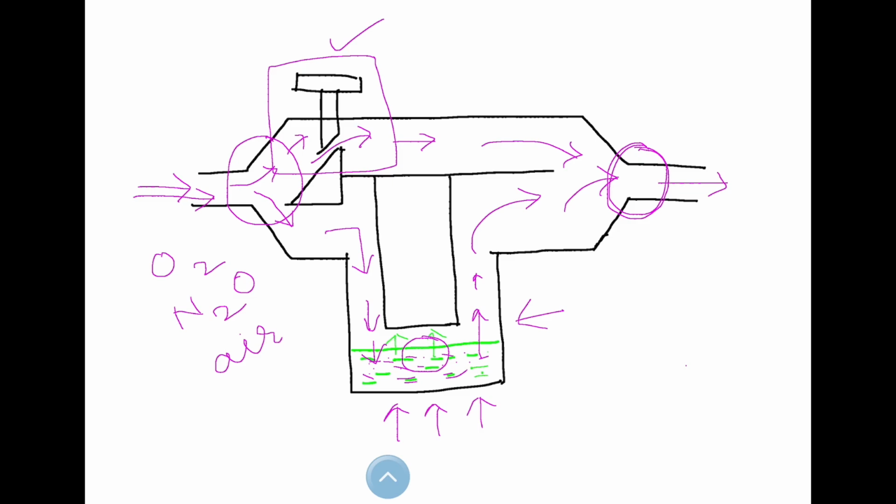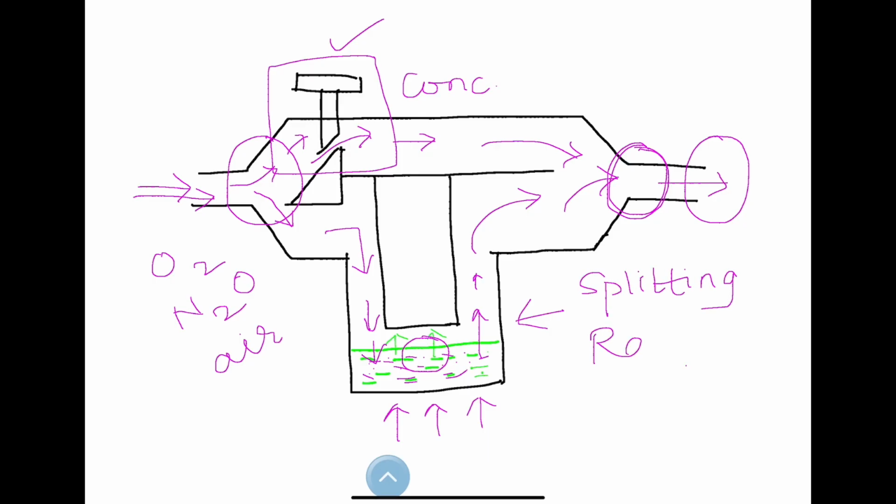The dial will control what ratio of fresh gas flow bypasses the vaporizing chamber to that of the gas that enters the vaporizing chamber. This also makes it concentration calibrated. Both gas flows join downstream of the vaporizing chamber, where gas exits the vaporizer at the desired concentration. The ratio of bypass gas to the gas going to the vaporizing chamber is called the splitting ratio and depends on the ratio of resistances in the two pathways.